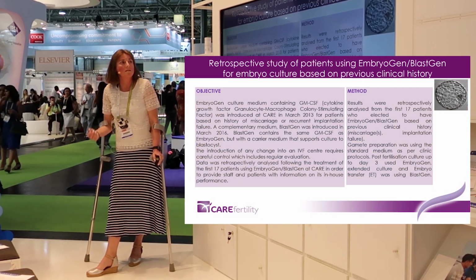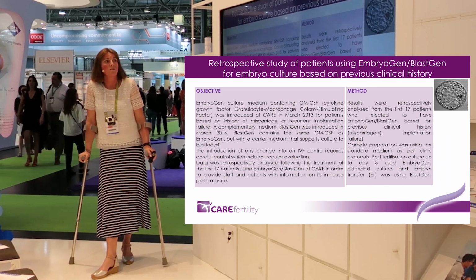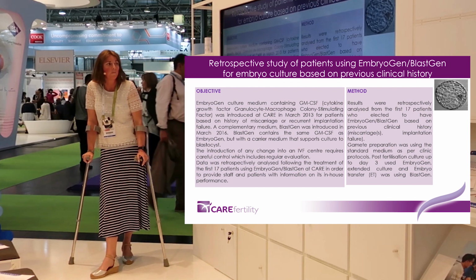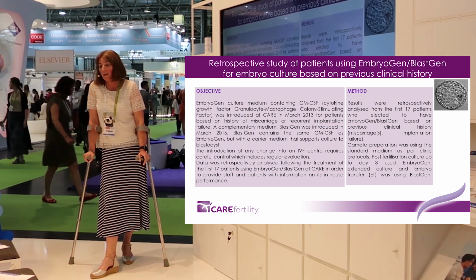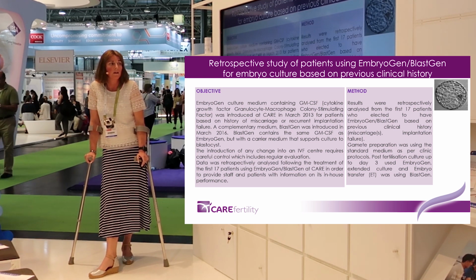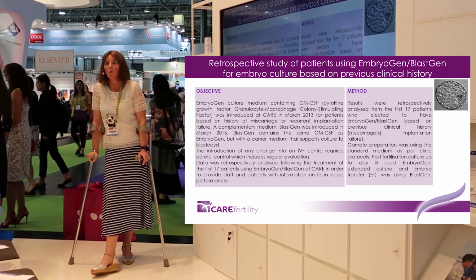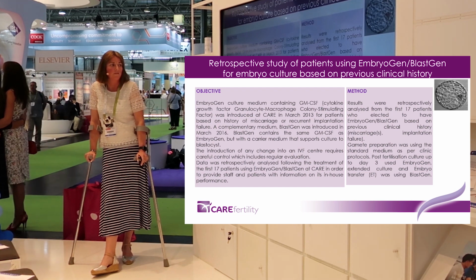So again, we looked at our own in-house data regarding the use of the Embryogen and Blastgen based on the previous clinical history. And we introduced Embryogen into care in March 2013. At that point, there wasn't a Blastgen. So the embryo transfers occurred either on day 3, or if they were a blastocyst transfer, the embryos were put into our standard culture medium after day 3 up until day 5.